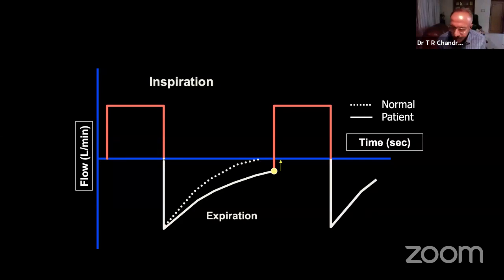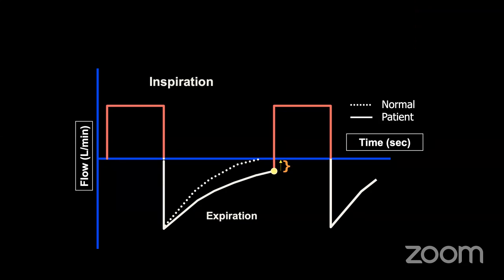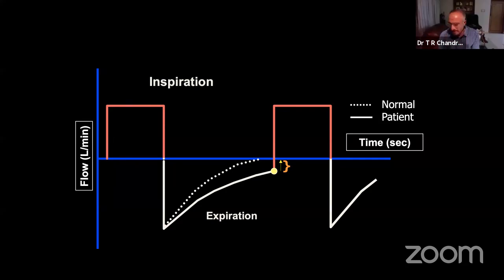You have to make the PEEP 0, or else if you have set a PEEP of 5 and the baseline is starting from 8, which is so visible, that is the auto-PEEP. Yes. But to actually determine it, you have to do that procedure. But what it shows should make you aware that something is happening. See, this is what you see.